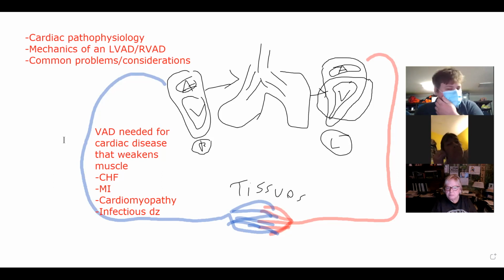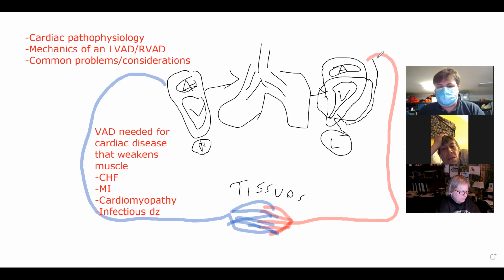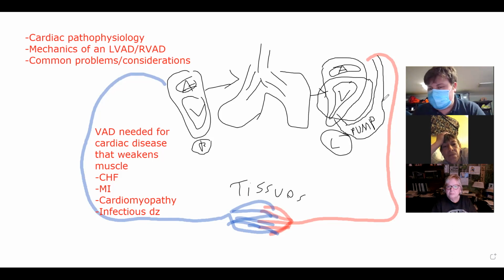So what are the intentions of someone who is receiving a ventricular assist device? Well, I think the best way to answer that is to tell you a little more about what a ventricular assist device is and what it looks like. Basically, a ventricular assist device is a fancy pump that connects the bottom of your ventricle with the outgoing blood vessel from that chamber of the heart. And there's a pump in the middle here that's basically shuttling the blood from the ventricle up to the exiting vessel on the corresponding side of the heart.